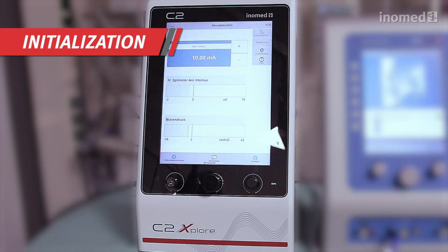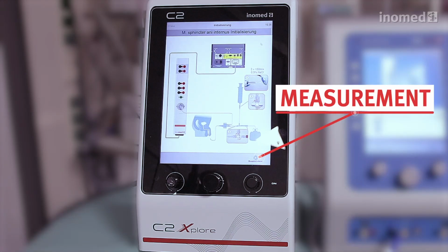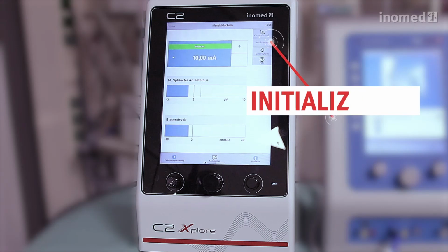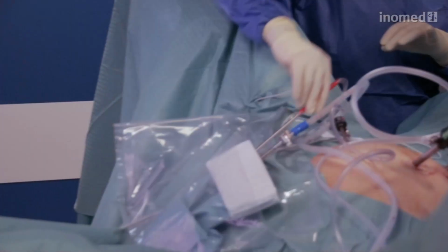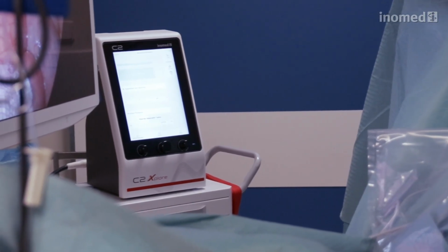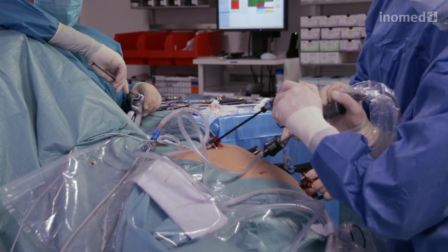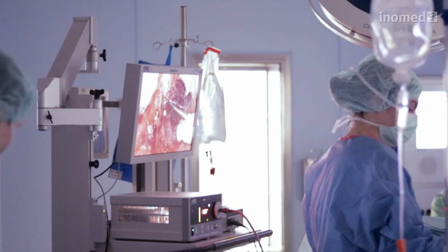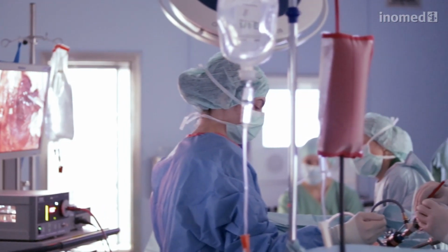Before performing any measurements and after making any changes regarding the patient, such as a different position on the OR table, an initialization has to take place. For this, the initialization button of the C2 has to be pressed, and the thresholds for the internal anal sphincter and bladder pressure will be set automatically. Once the stimulation probe has been positioned close to the operation site, the electric stimulation can be started.